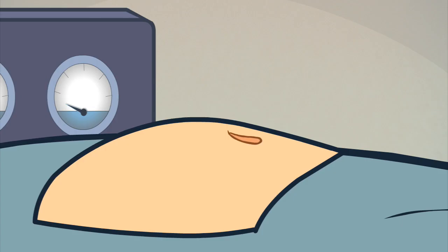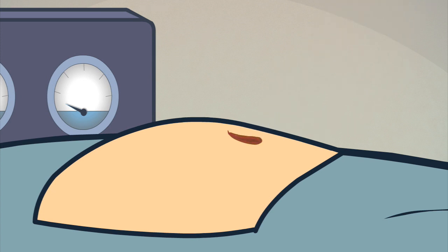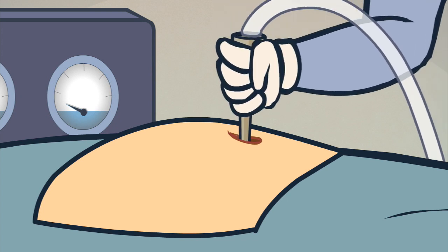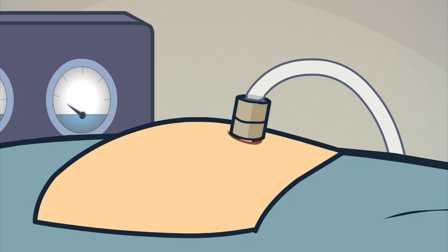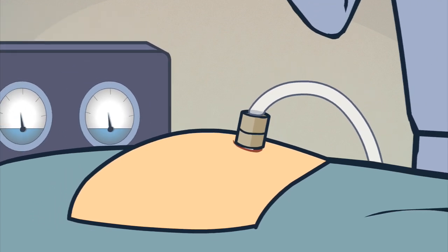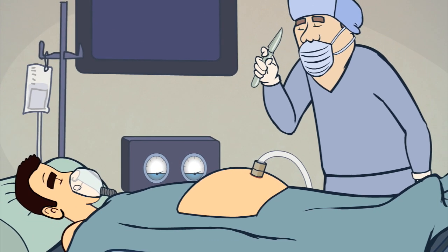Most of the laparoscopic colon surgery is now done in what we call a hand-assisted laparoscopic fashion. An approximately 2 to 2.5 inch incision at the level of the umbilicus, or belly button, is created. And through that incision we place the equivalent of a rubber dam. What this allows us to do is something called insufflation, where we inject carbon dioxide into the intra-abdominal cavity, which elevates the abdominal wall up off the organs, somewhat like blowing up a balloon. And it gives you room to work inside the abdomen.